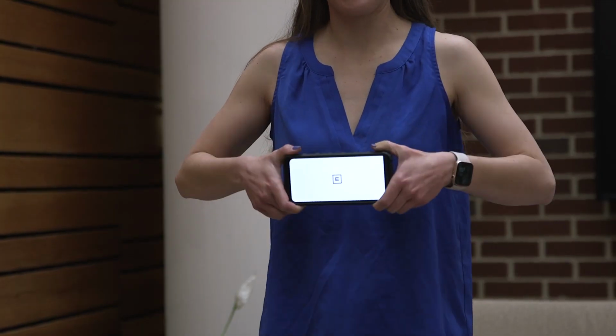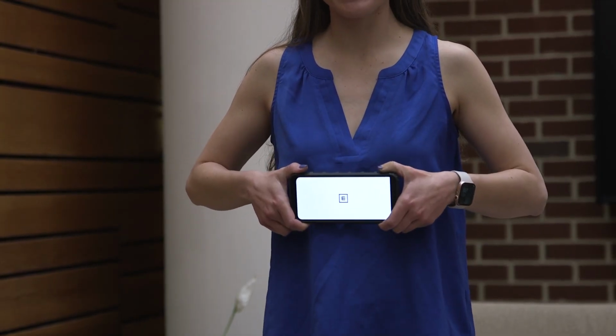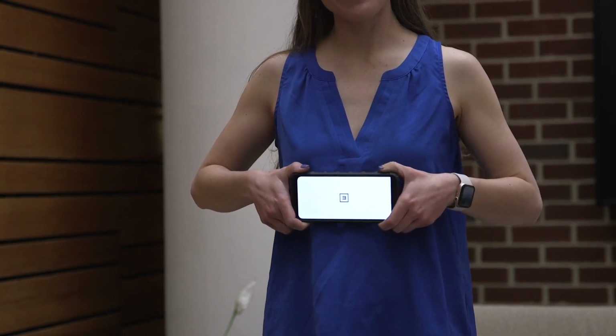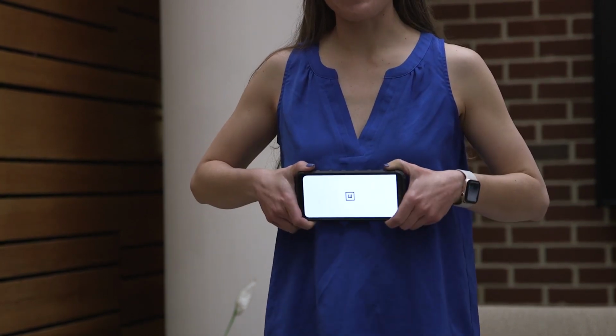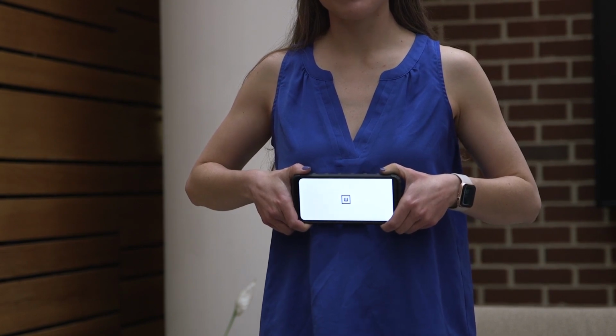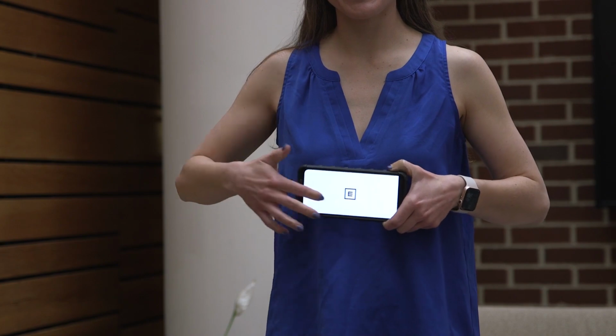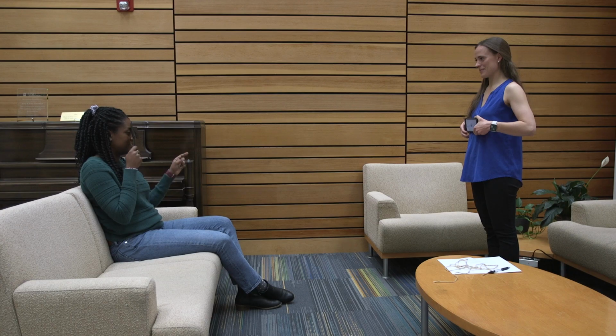If they still cannot see which direction it is facing, shake the phone again to skip to the next letter. You may have to skip multiple E's before the participant is able to see the E well enough to tell you which direction it is facing. Even if the participant has to skip some letters, the exam will continue until it has determined a score for the participant and you hear the final noise.